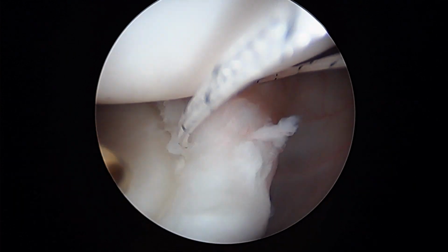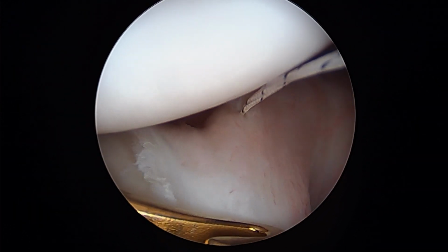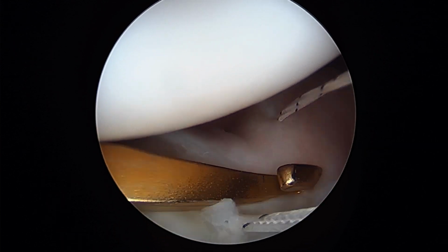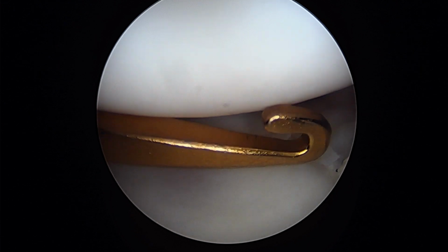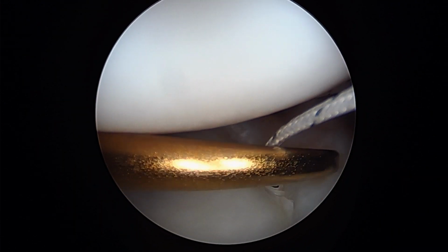Okay, so we've got the first stitch passed. Lift up again on the shoulders a little bit. You can see it's actually coming right through the anterior band of the inferior glenohumeral ligament, so that's good. We're going to do a mattress stitch, but not a figure 8 in the front. So that means we just take the second stitch here.